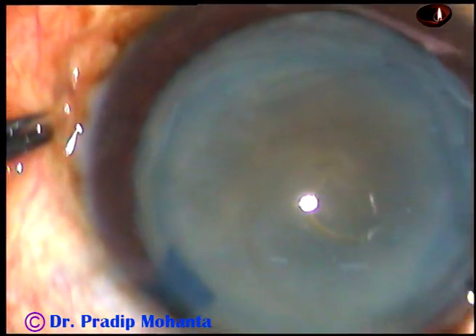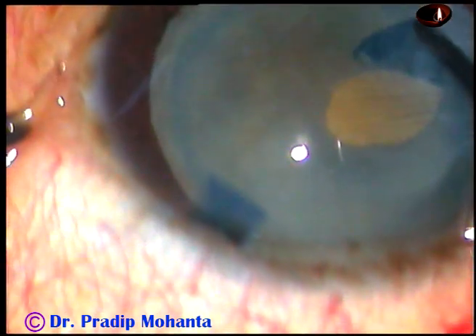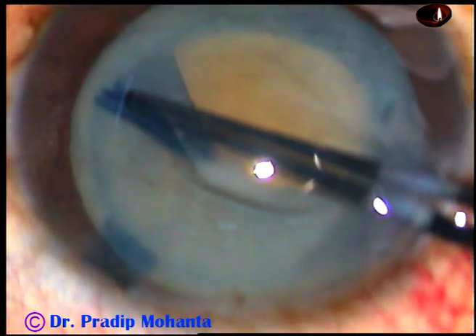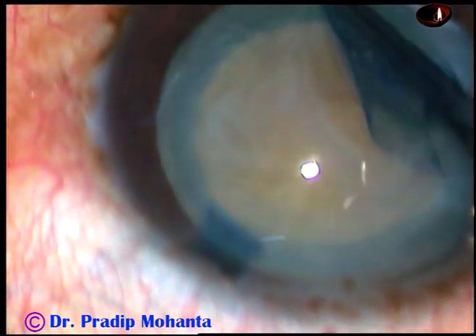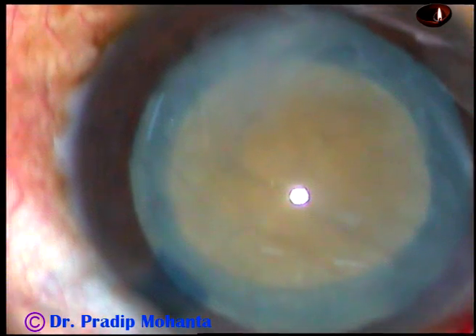And now I take a utrata forceps and do an adequately sized rhexis. At this time, I can judge that the zonule is okay in this case. There is no zonular weakness, so I need not use a capsular tension ring in this case.